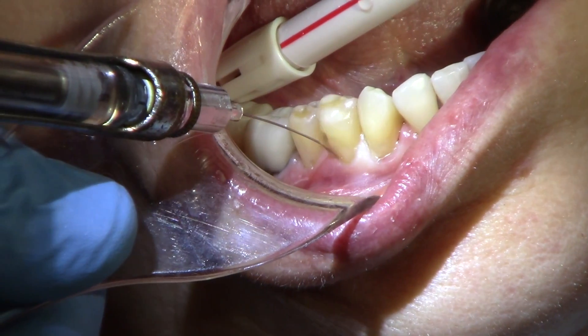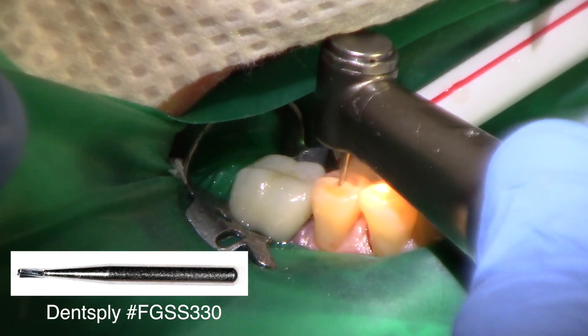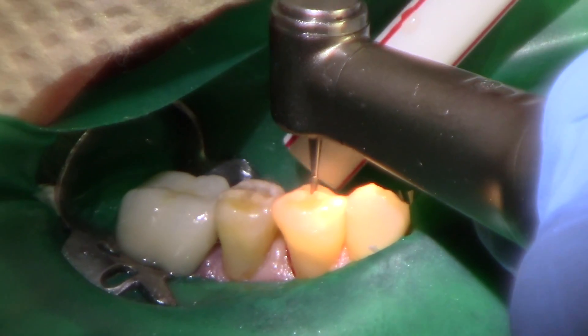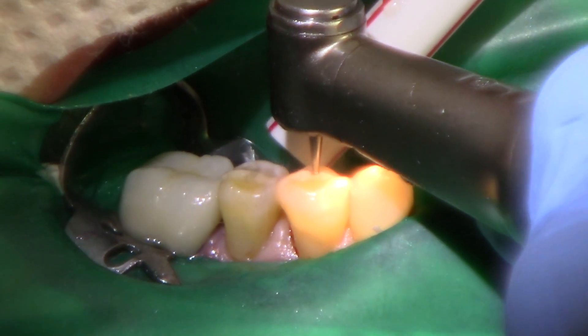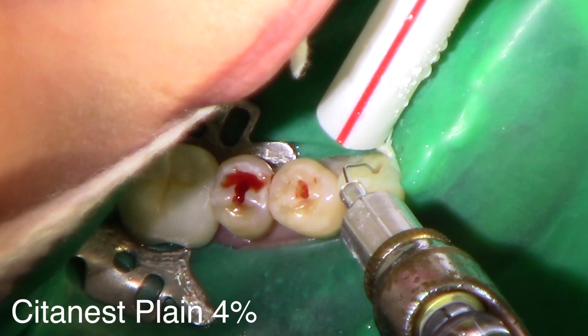After providing a mandibular block, you must provide intrasulcular local anesthesia. A 330 carbide burr for the access opening. Be sure to check your radiograph preoperatively to be sure where the nerve is, and you'll feel it just fall into the pulp chamber.